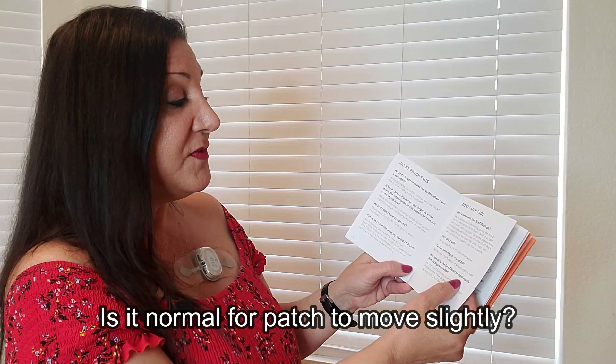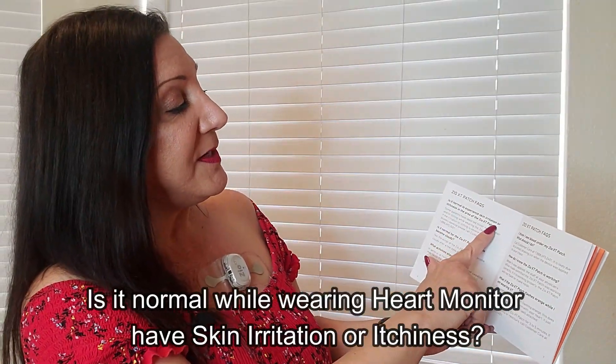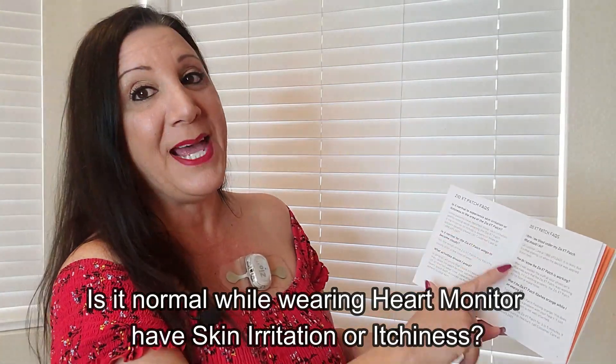Is it normal for the Zio XT patch to move slightly from its original position? Yes, it may move slightly, and a blue gel may become visible under the wings. When wearing clothing, some lint may collect around it due to the stickiness — no big deal. Is it normal to experience skin irritation or itchiness? Yes. A lot of days I felt compelled to itch, but try to ignore it and it will go away. If the irritation is severe or hives or blisters develop, call customer care at 1-888-693-2401.